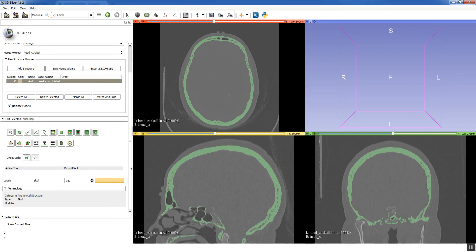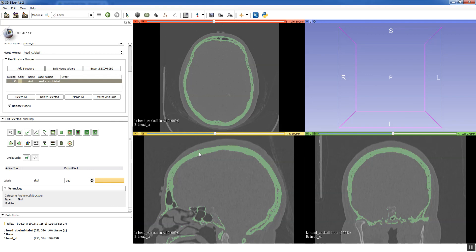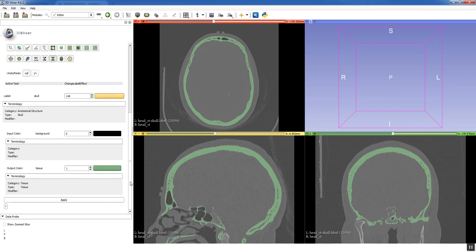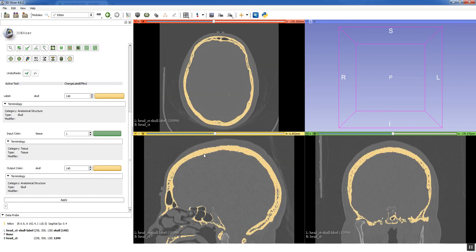So the last thing I want to have you notice is that the intention was we are labeling the skull with the color 140. Now if you hover over here, clearly that's not the same color. And it's actually the tissue 1 label. I'm not sure why the labels get reassigned so easily. But I want to just for the sake of consistency. And when you start generating models and saving things, it's best to have those labels match up. So I'm going to change this green to a yellow. And I'm going to do that with the change label effect. So this button here, if you click it, change label. The input color is 1. And the output color is 140. I'm going to apply that. And you can see we're back to the skull being actually a skull 140 if you look down at the data probe.